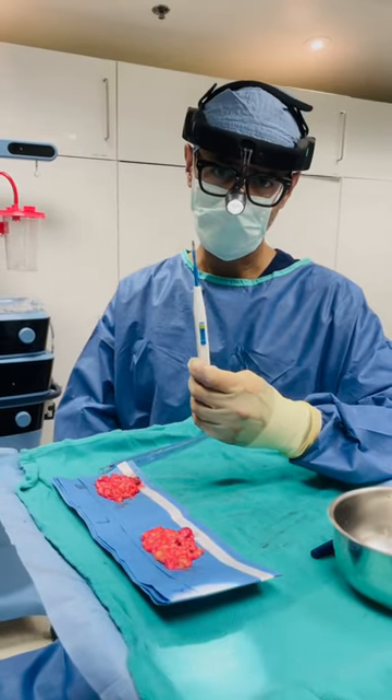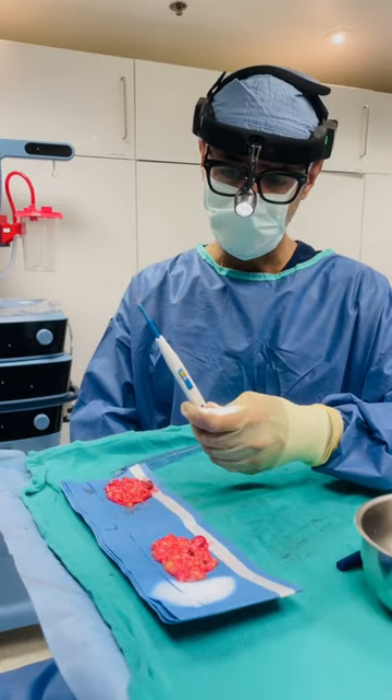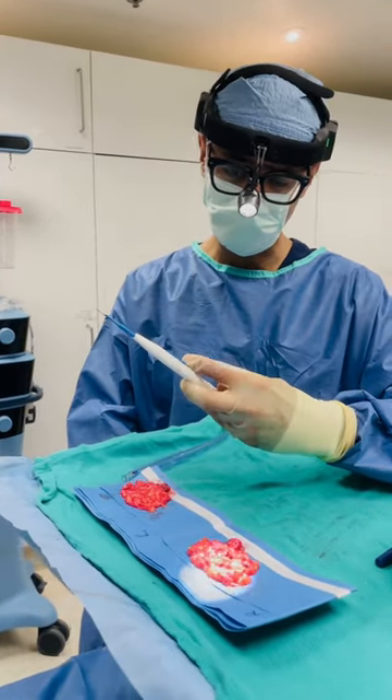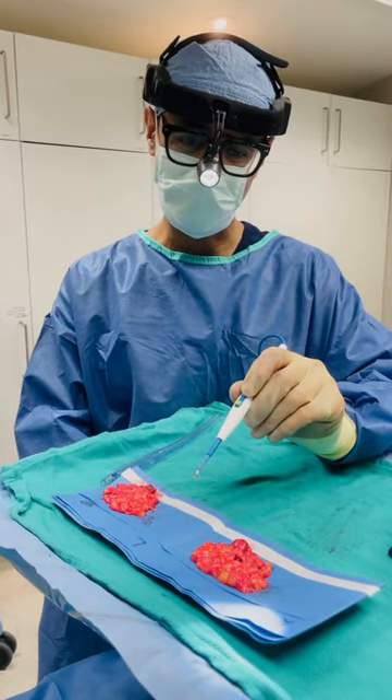This is another really important tool in surgery. This is called a bovie pencil or an electrocautery pencil, and what it does is it allows me to dissect tissue but also stop bleeding at the same time.